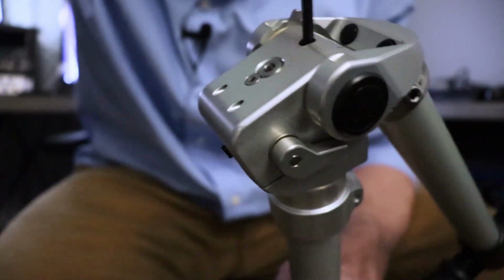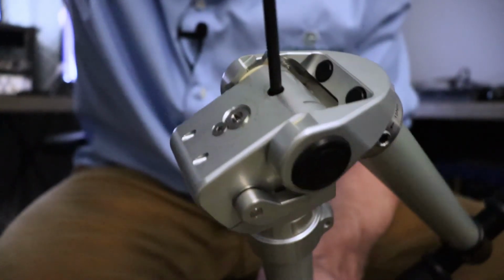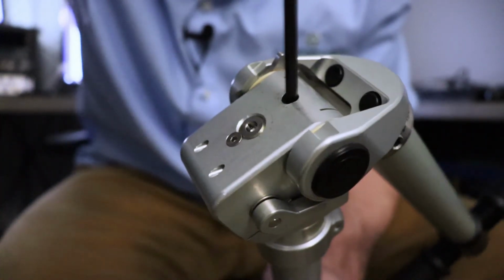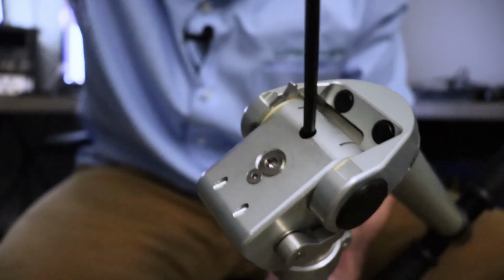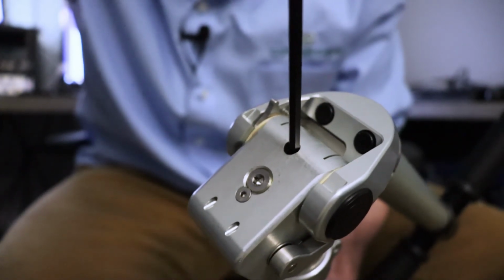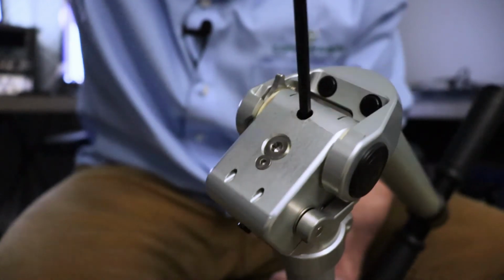Then you can adjust it. And it does take quite a few turns to reach from one end to the other. So if you're turning it and you feel like it's not doing anything, it may just be that there's a lot of turns. You can see I'm still turning it, and that's the other end. There's one end to the other. So as long as you're feeling some resistance when you turn it, you should be good.